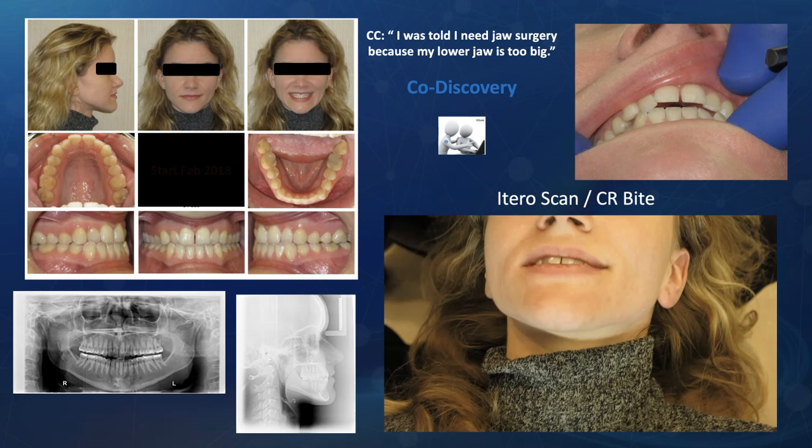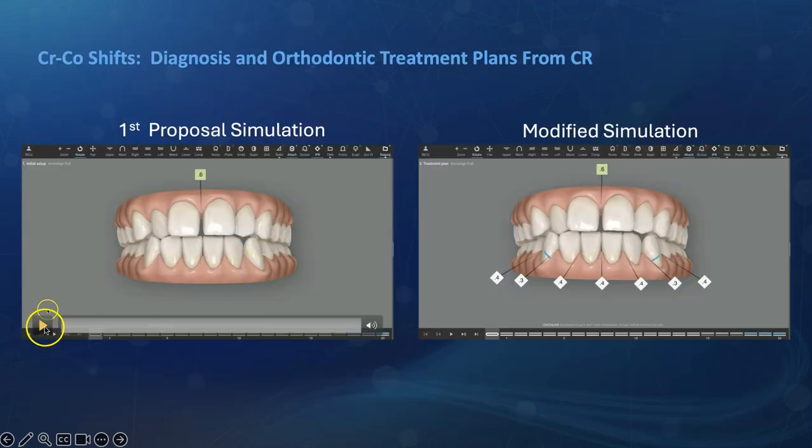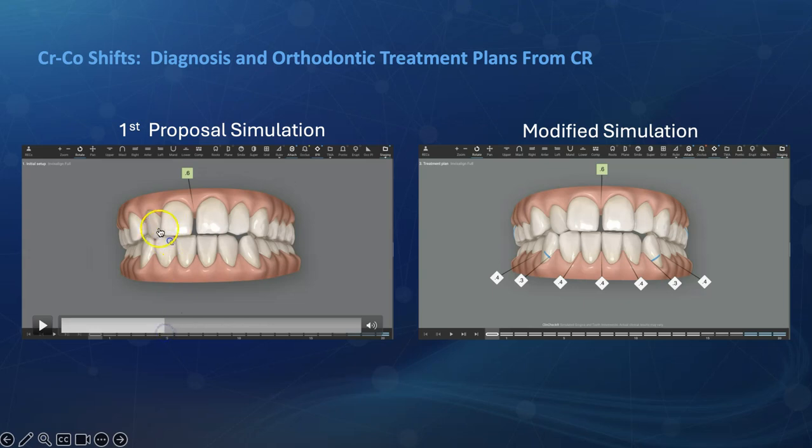This could be very different in many different cases, but the main idea is that you'll notice that when the scan was being taken, you could see on the screen the posterior open bite. And this relates exactly to the posterior open bite that now we're going to see in our scan here of the bite. So you see these teeth are not together on the right, and they're not together on the left, and they're being held open by that one contact on the lateral.